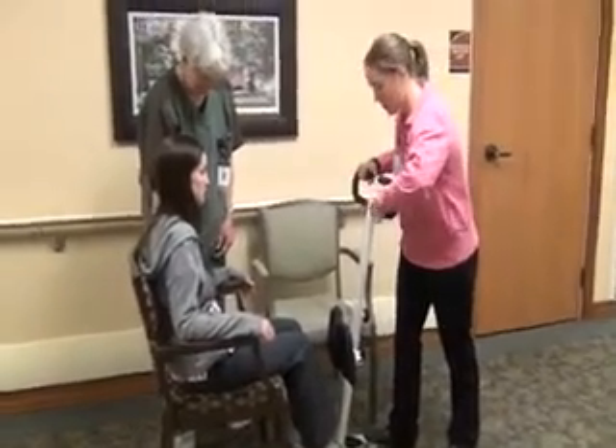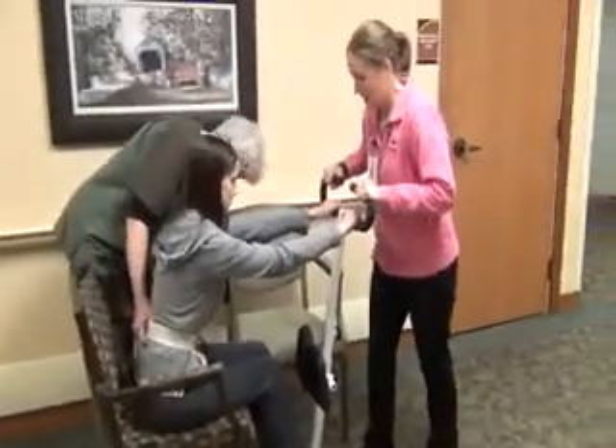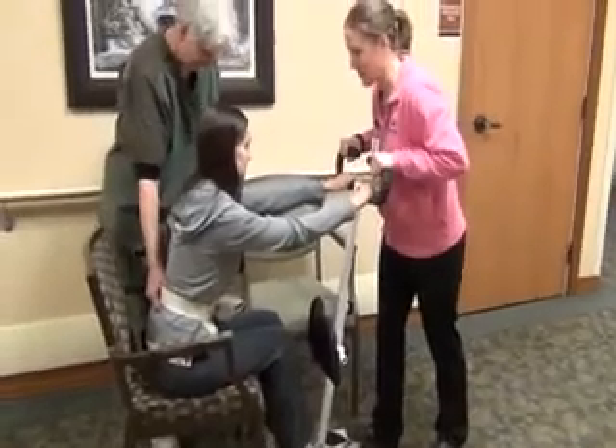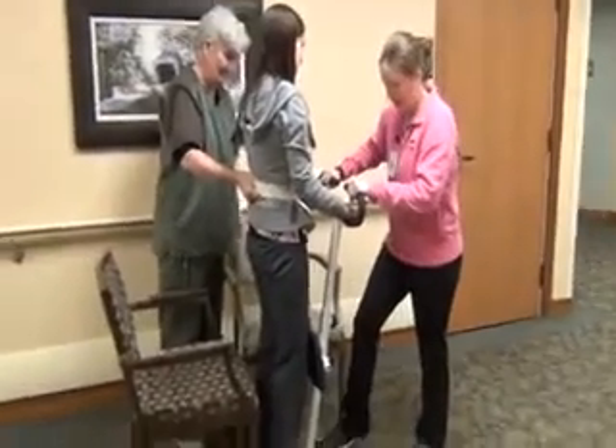We're going to ask the patient to place their hands right up here. Once your partner is ready, we're going to have the patient go ahead and stand up — one, two, three. Once the patient is standing up fully, you can let the brake go.